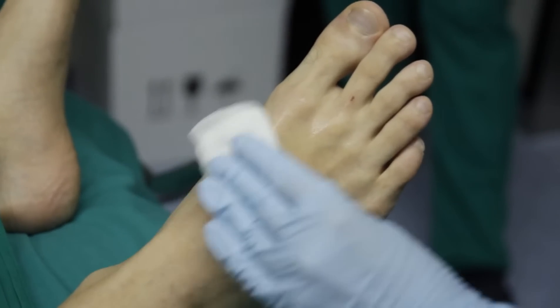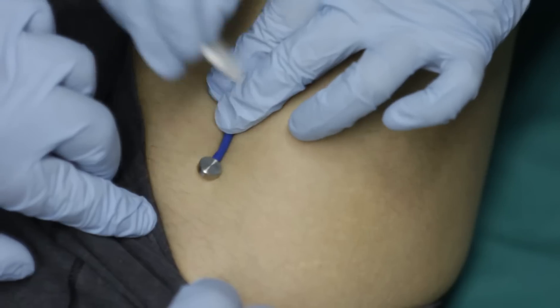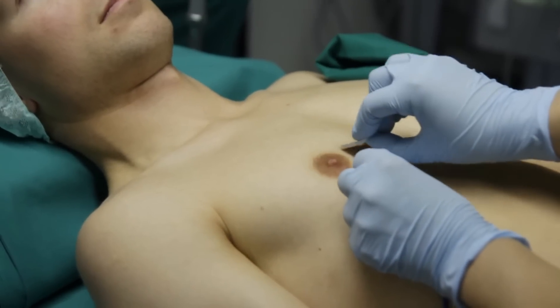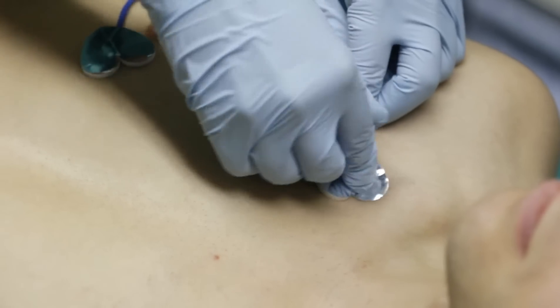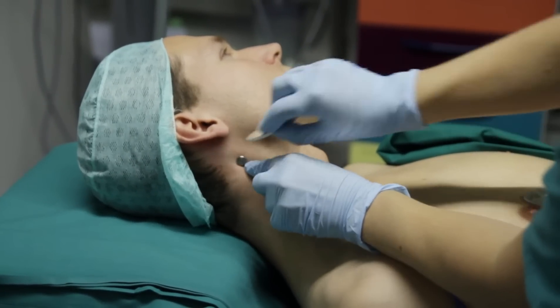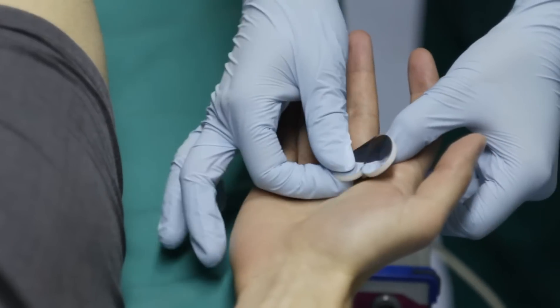Starting from foot to head: dermatome L5 on the back of the foot, L1 in the groin, T4 at the mammillary region, C4 underneath the collarbone, C2 behind the ear, and C7 at the palm of the hand.